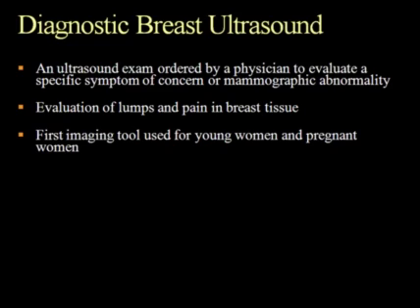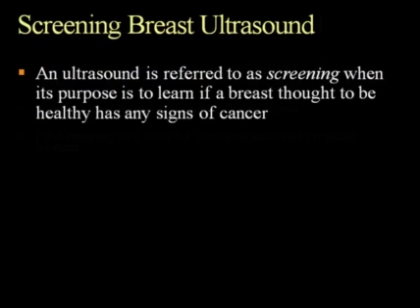Diagnostic breast ultrasound specifically is an ultrasound exam ordered by a physician to evaluate a symptom of concern or mammographic abnormality. It's also used for evaluation of lumps and pain in the breast tissue. And as I said on the prior slide, a first imaging tool for young women and pregnant women.